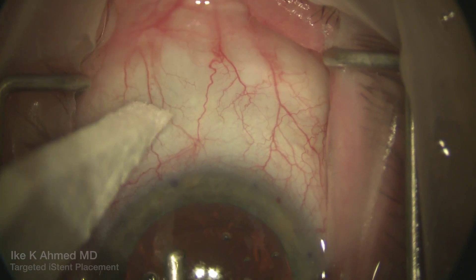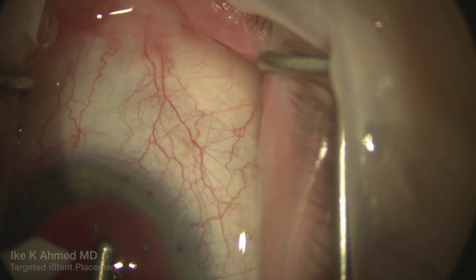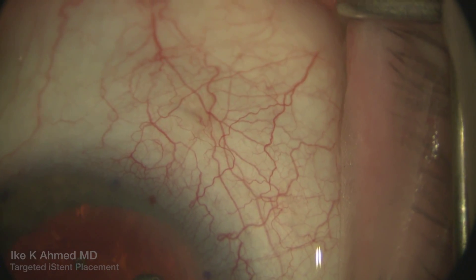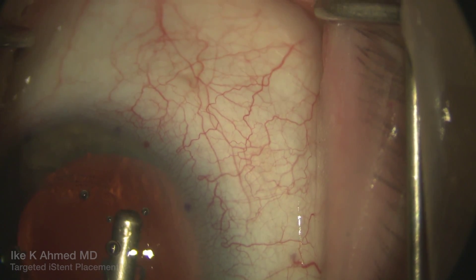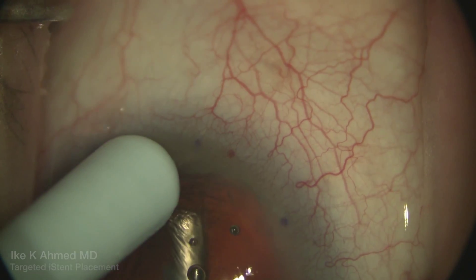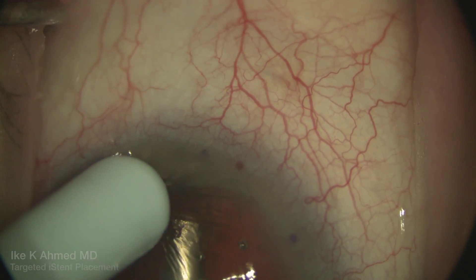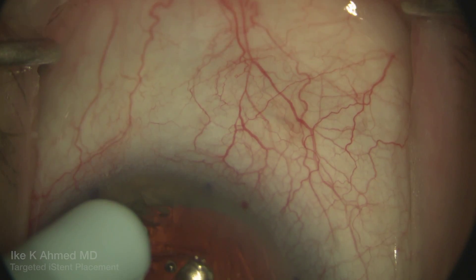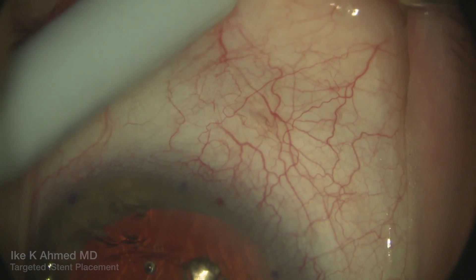We can see some of the conjunctival vessels as well as the underlying episcleral vessels blanch with the irrigation. We're alternating this with holding the irrigation to allow the pressure to drop and blood to reflux back into the veins. We can actually see some of the blanching and laminar flow in the same area where we described the aqueous vein preoperatively, with changes in IOP resulting in changes in episcleral venous pressure showing where those vessels are.